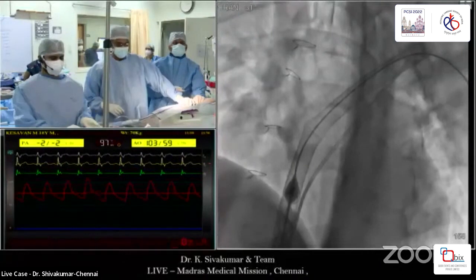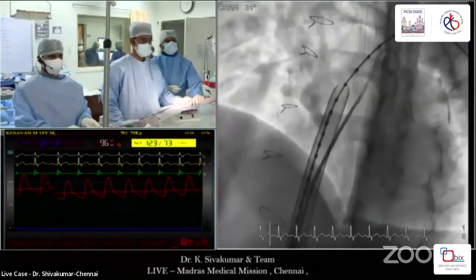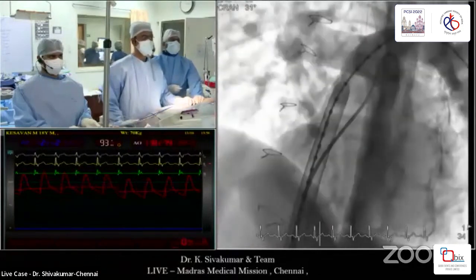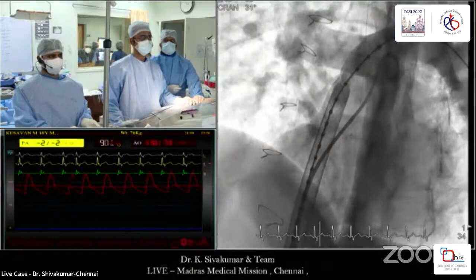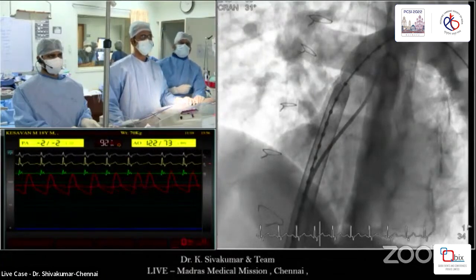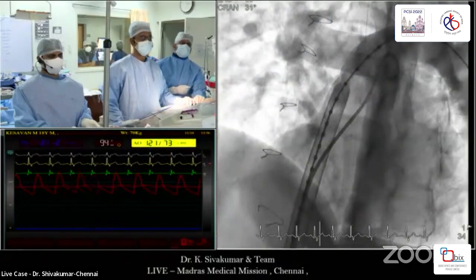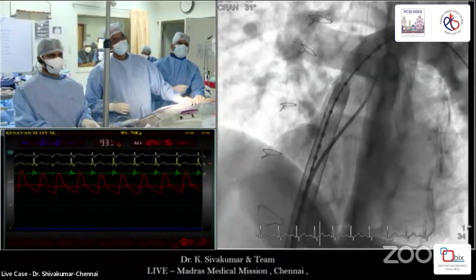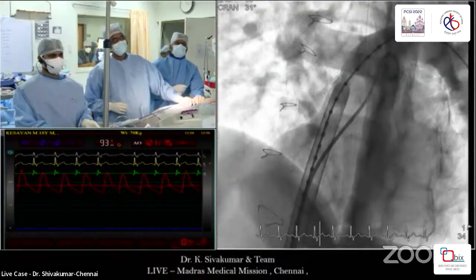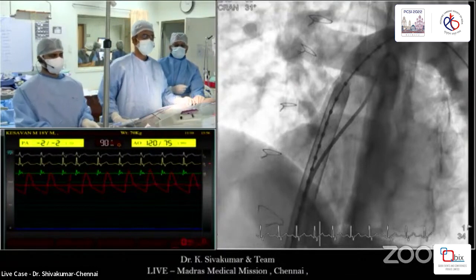You might be all right. Whereas in the right pulmonary artery, when you pull the distal flare back, then you've got a bit more control in keeping the distal flare in that tapered part. So that would be the only thing that you'd have to think about. And if you've got a good sheath in the main pulmonary artery and the distal flare comes back too far, then you should be able to retrieve it. So that would be the only thing, but otherwise the choice is fine.